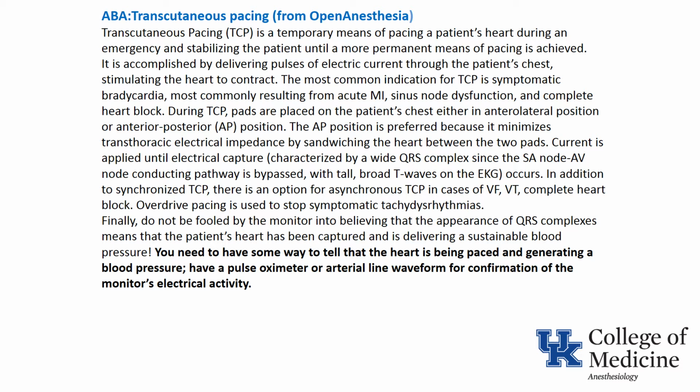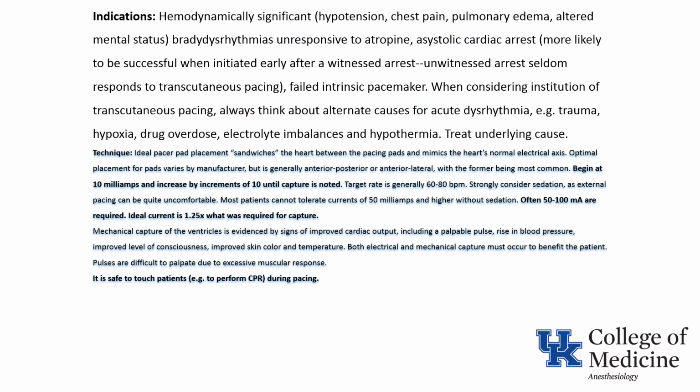When it comes to transcutaneous pacing, it's up to you to know how to use the equipment that the hospital has provided for you. That may require you to refer to YouTube videos or to the instructions for use, or perhaps have the vendor come into the hospital and show you how to use it properly. Now, personally, I've never paced a patient transcutaneously, but the next few slides do summarize how to do it.